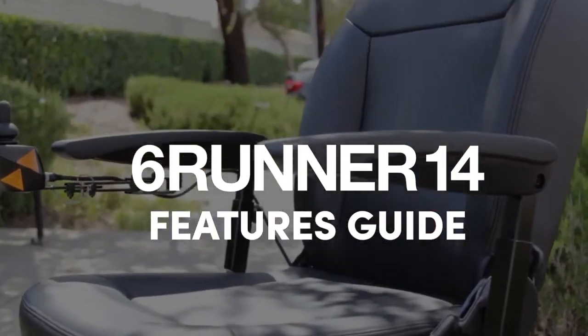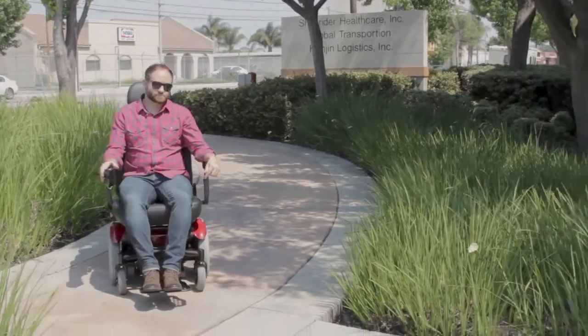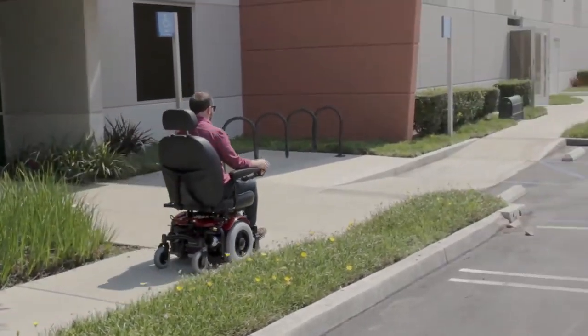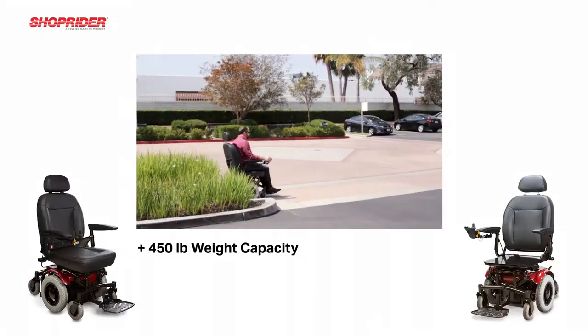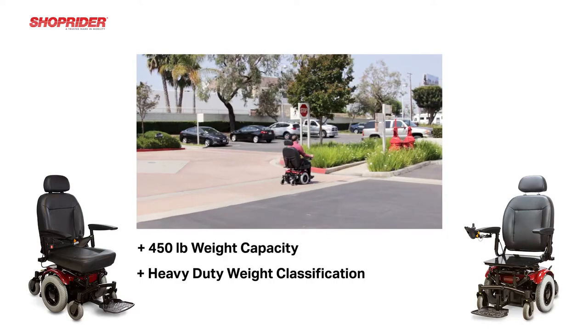Introducing the 6Runner 14 from ShopRider Mobility. This power chair is coded as a K0824 with a rehab style seating available, and a K0825 for the captain or van style seating. This particular chair with these codes has a 450 pound weight capacity, a true heavy duty designation for this particular product.